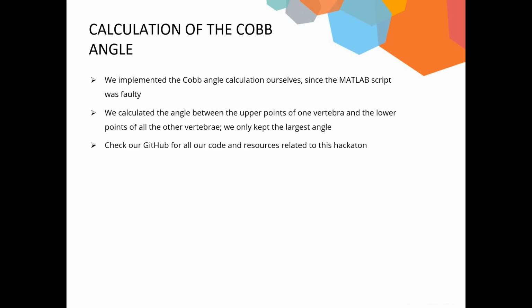If you want to see our implementation of the Cobb angle calculation, or of anything related to this hackathon, take a look at the GitHub repository we provided. All the resources related to this hackathon are there.